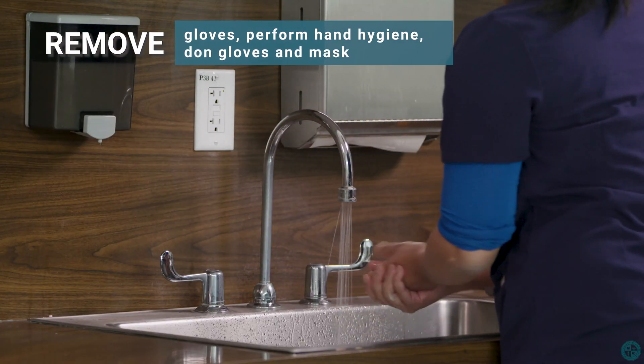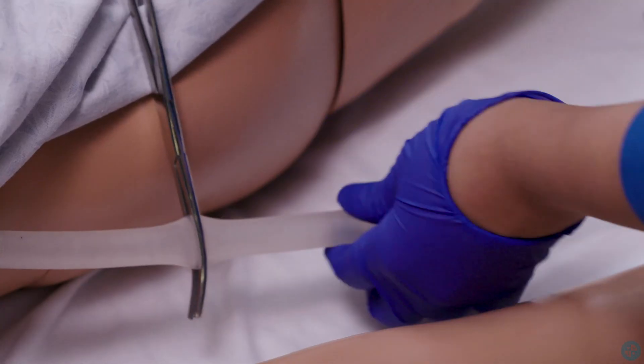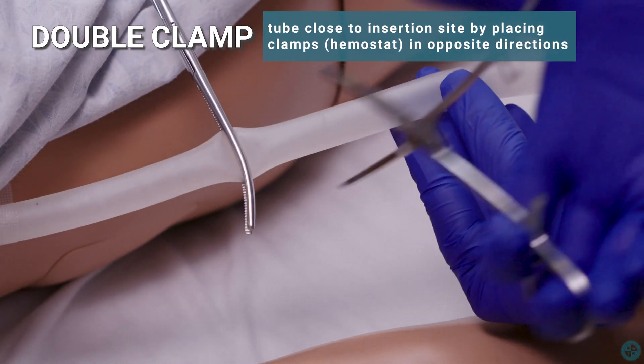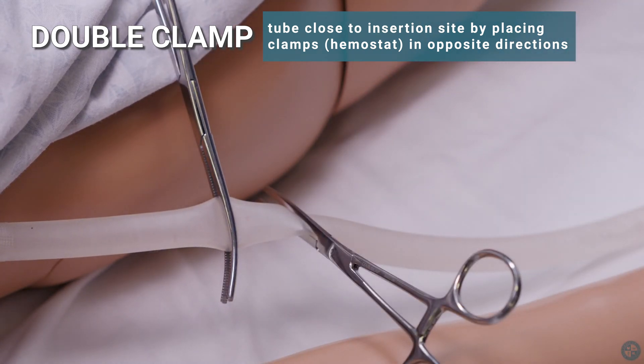Remove gloves. Perform hand hygiene. Don gloves and mask. Double clamp tube close to insertion site by placing clamps, hemostat, in opposite directions.